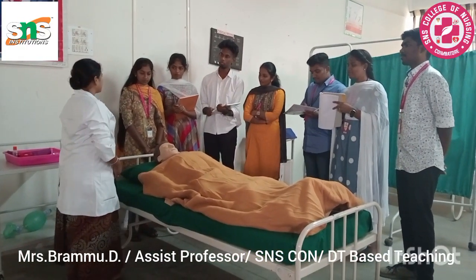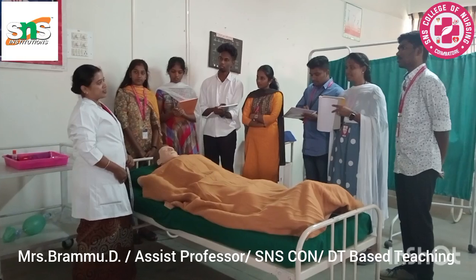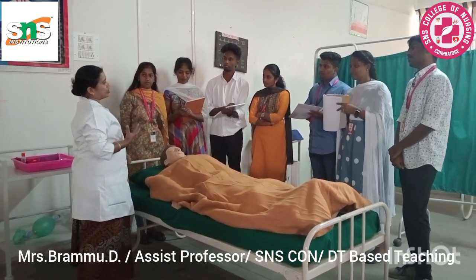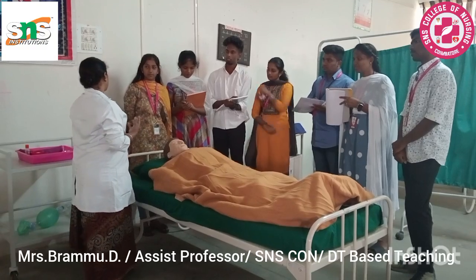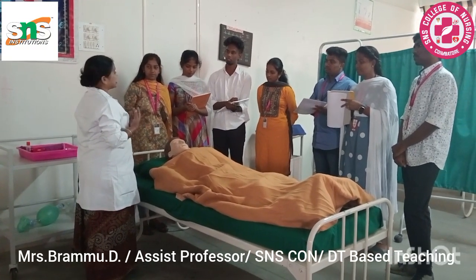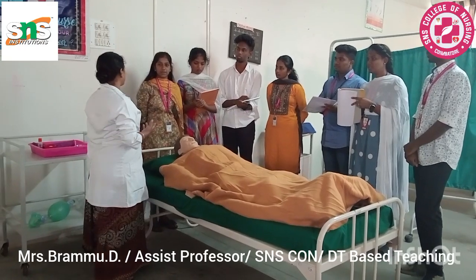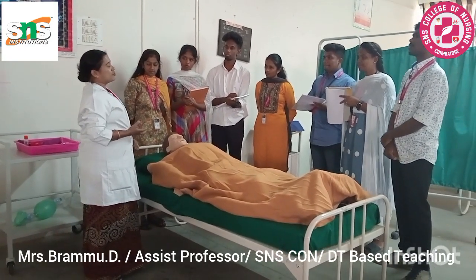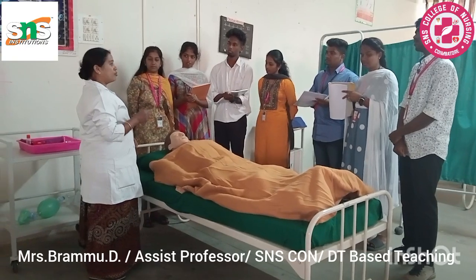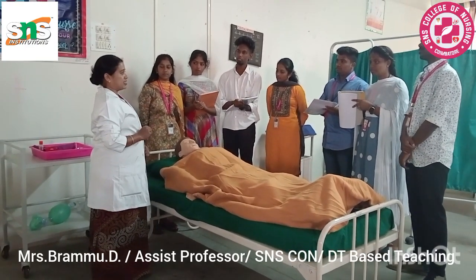So today we are going to see about heart auscultation. We all know the heart is the major organ doing the pumping action, where the sound is produced as lub and dub sounds. Are you aware of it? Yes, ma'am. So today we are going to see how this lub is generated and how we can auscultate with the help of the stethoscope.